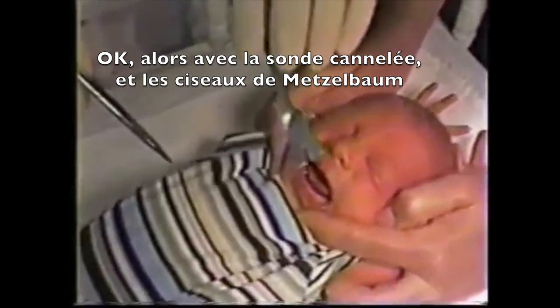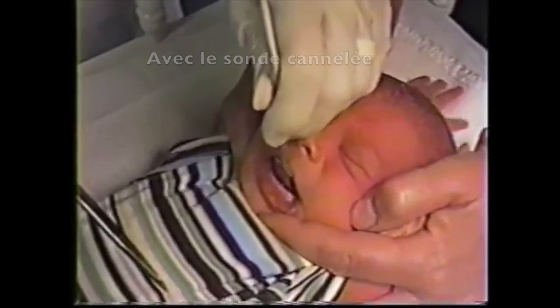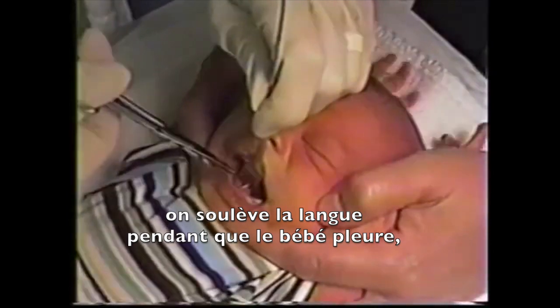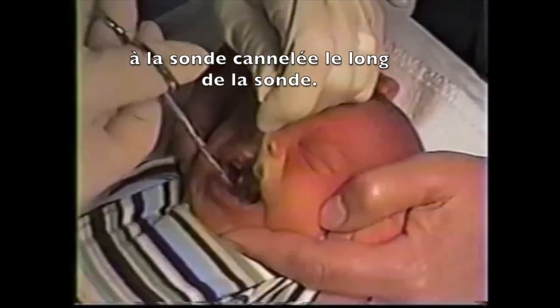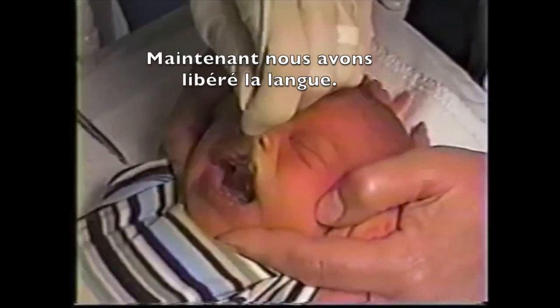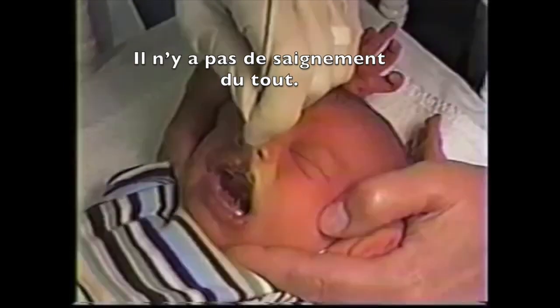Now with the grooved retractor — this is the grooved retractor, and these are iris scissors. With the grooved retractor you raise the tongue while the baby cries. You snip the frenulum parallel to the grooved retractor and stay close to the retractor. And now we have a release of the tongue. There's no bleeding whatsoever.